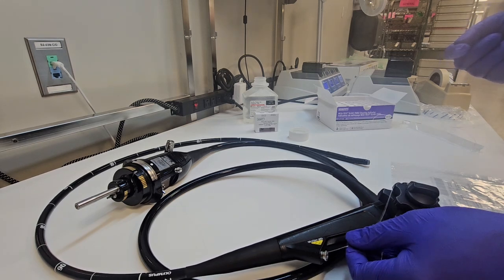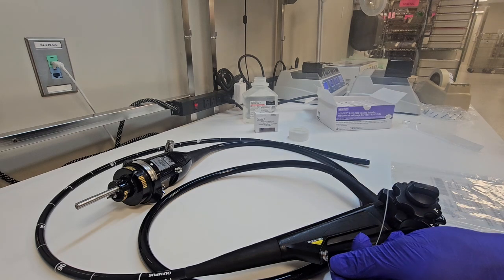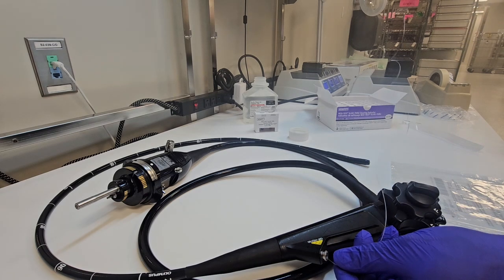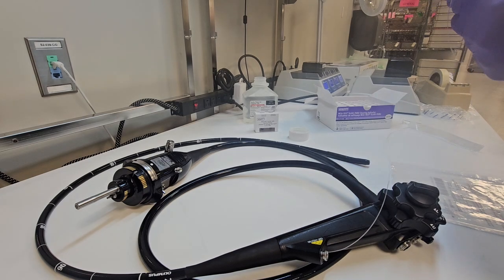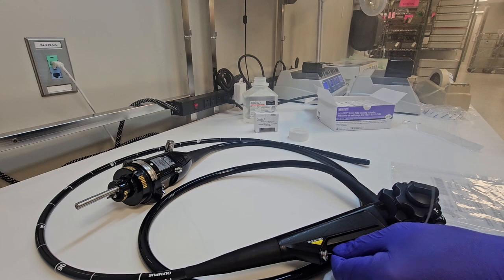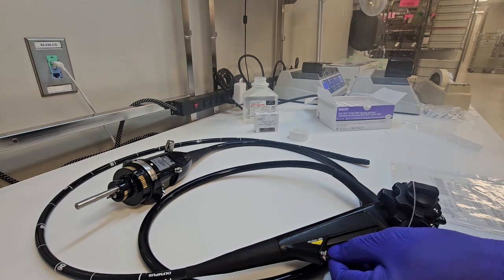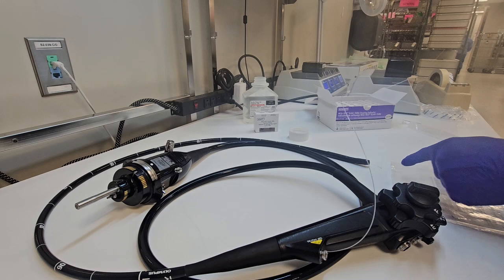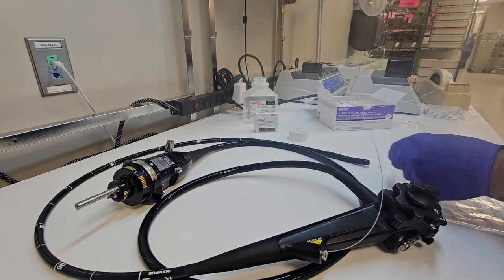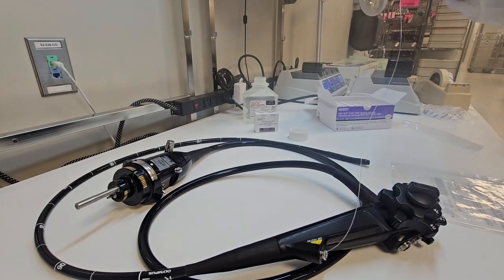This one requires that the distal and proximal end of this squeegee be moistened with water prior to pushing through to help ease the friction. And when you're doing that, you want to make sure you're not hitting any other surfaces and use the water stated by the IFU. You want to advance that brush nice and slow until it exits the distal tip.